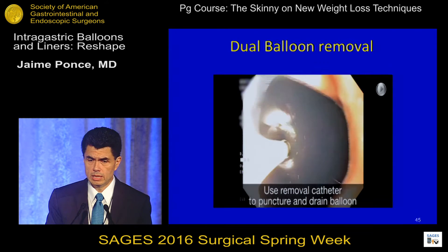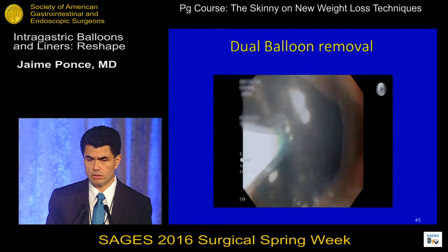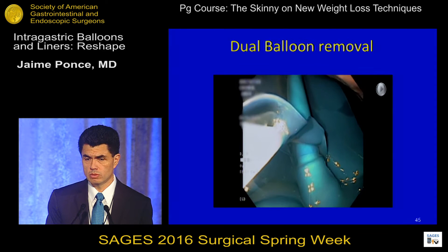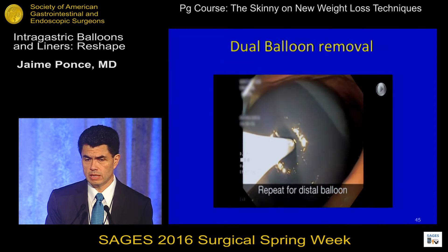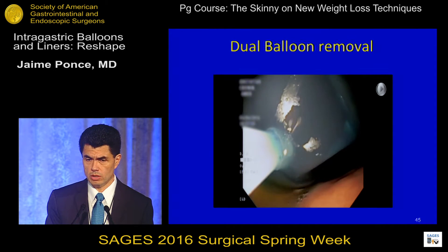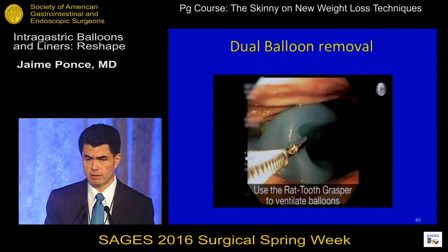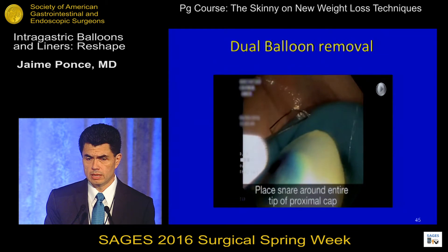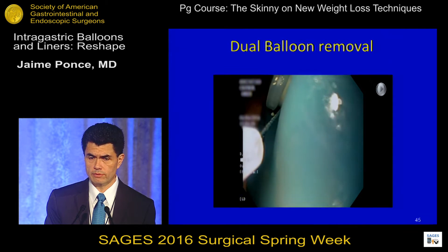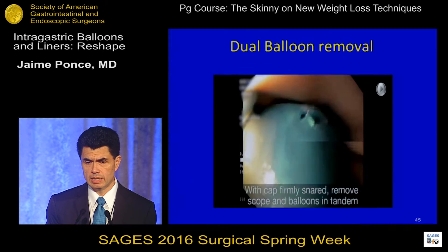This is a video of the removal. We can see the balloons and the suction catheter puncturing a balloon in a perpendicular fashion. The catheter is slid in and put on wall suction until the balloon is completely deflated, then the same is repeated on the distal balloon. When both balloons are deflated, the rat tooth grasper takes a bite of each balloon to ventilate trapped air. This is the second balloon being deflated. We then lasso the proximal tip with a large snare for careful manipulation, push any tip that goes into the fundus back into the body of the stomach, and pull it out.